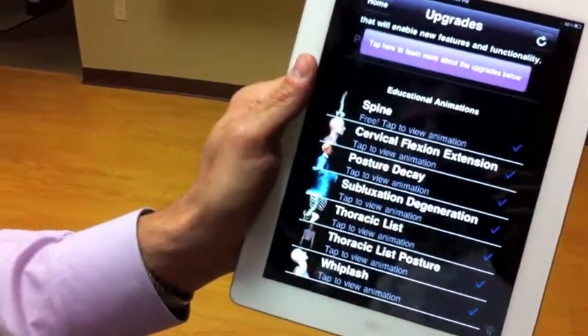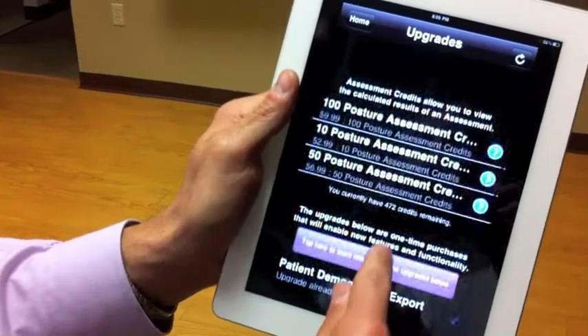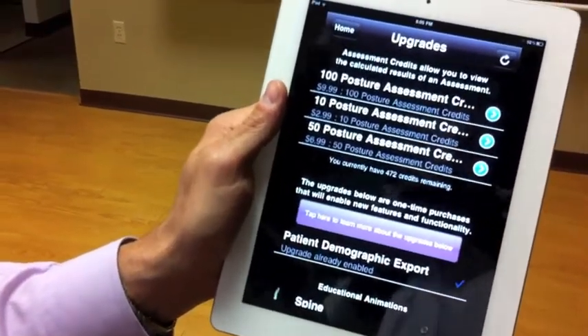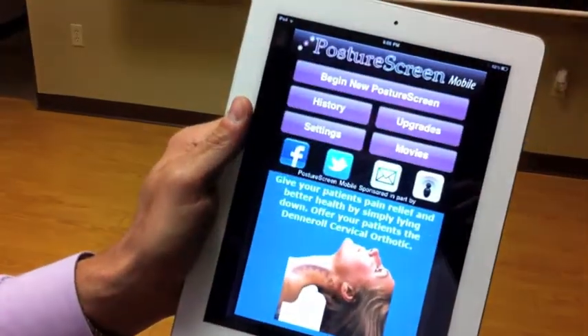They're all 99 cents, except for this one which is $1.99. And this is a $1.99 add-on as well. At the top, you buy the credits if you choose to use the credits and calculate the results. Those are the new features of version 1.3.